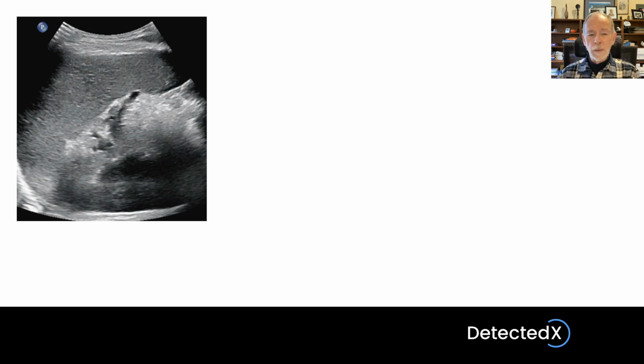Here's a clinical example. Ultrasound contrast agents, being so small, circulate throughout the body and throughout all of the vascular system. Over time, though, the liver removes the gas bubbles from the bloodstream and captures them in readiness for eventual excretion of those bubbles and elimination from the body.